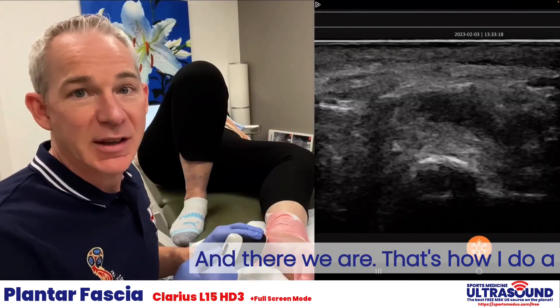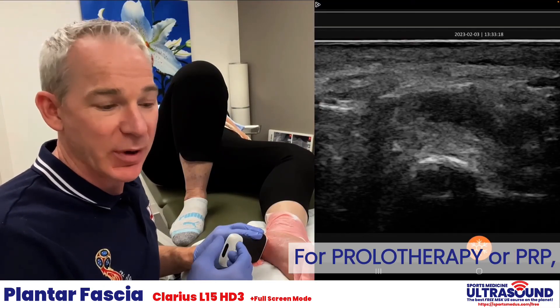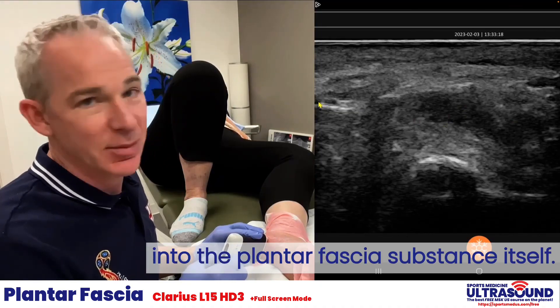And inject. And there we are — that's how I do a plantar fascia injection with cortisone. For prolotherapy or PRP I would place it directly into the plantar fascia substance itself.